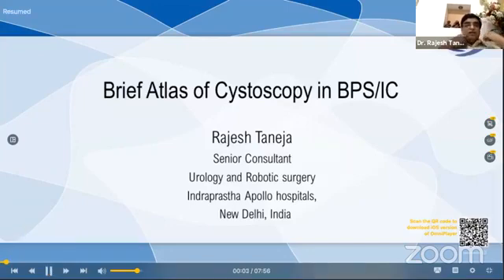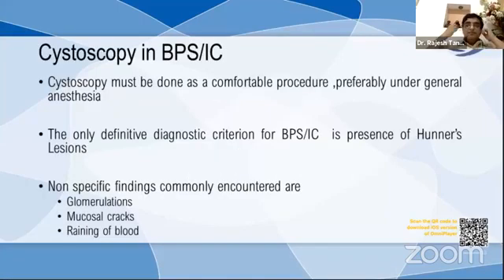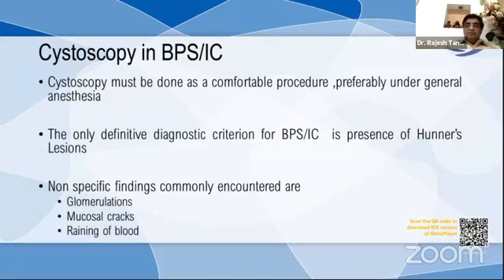In bladder pain syndrome and interstitial cystitis, cystoscopy must be done as a comfortable procedure, preferably under general anesthesia. The only definitive diagnostic criterion for BPS/IC is the presence of Hunner's lesions. Non-specific findings commonly encountered are glomerulations, mucosal cracks, and raining of blood.